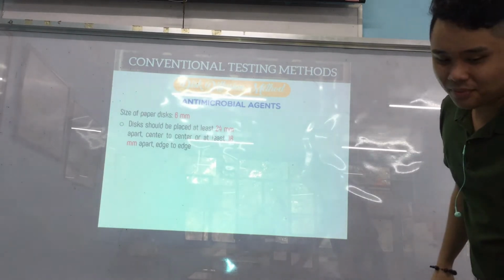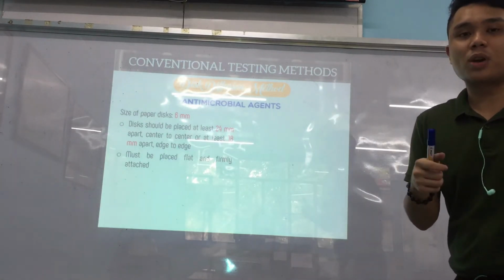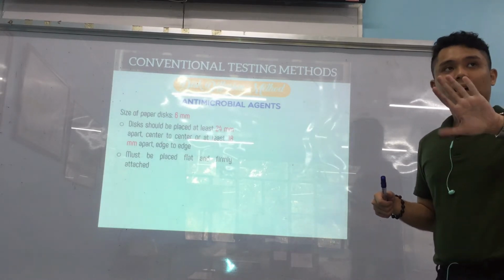Okay? Alright. Next, must be placed flat and firmly attached. Because again, we want to make sure na, di ba, pag incubate na to ani guys sa plate, dili mabali. Okay?